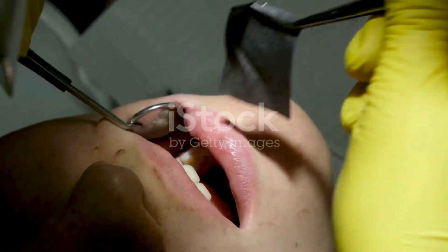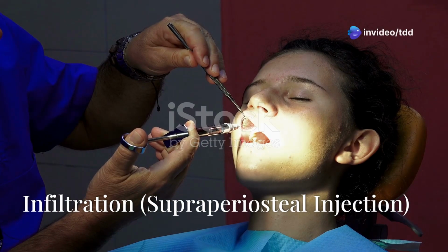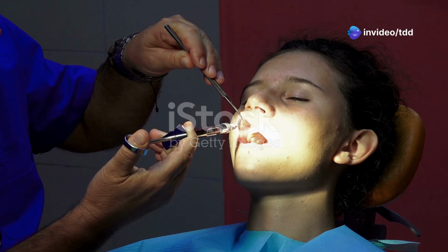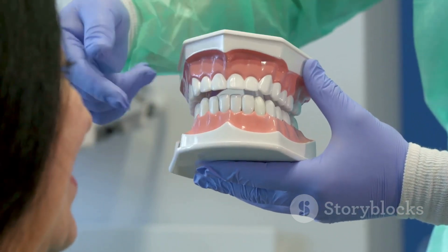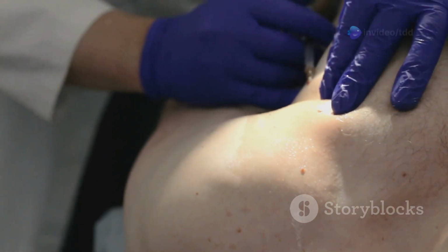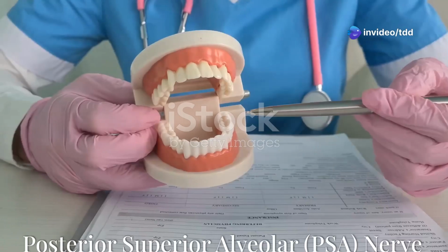Let's start with the most common method, infiltration anesthesia. Where to inject? Near the apex of the tooth you're working on. Landmark: find the mucobuccal fold above the root of the tooth. Example: for a maxillary canine, insert the needle at the height of the mucobuccal fold above the apex of the canine.